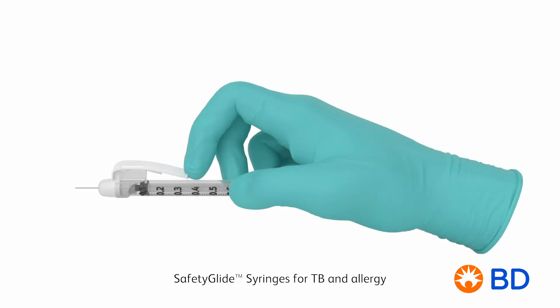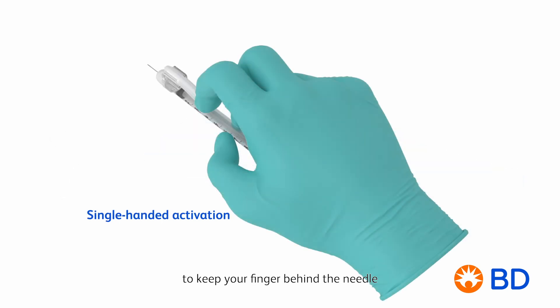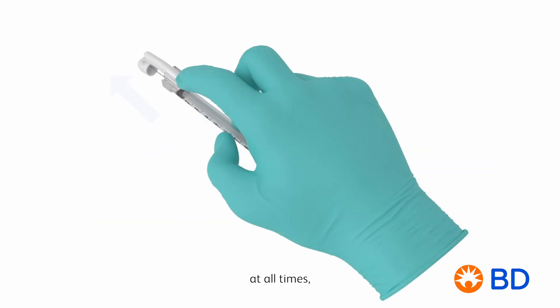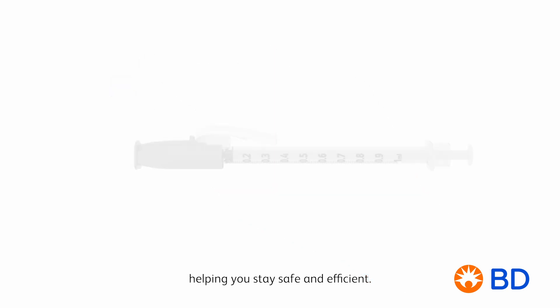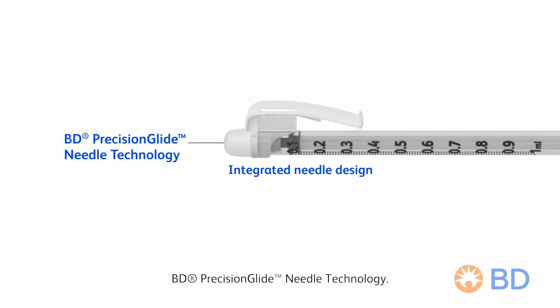SafetyGlide syringes for TB and allergy feature single-handed activation to keep your finger behind the needle at all times, helping you stay safe and efficient. The integrated needle design with low dead space utilizes BD PrecisionGlide needle technology.